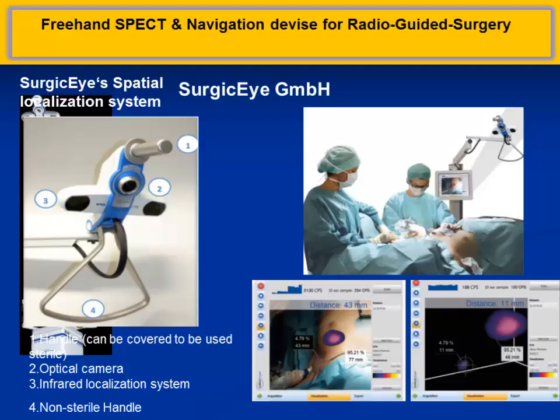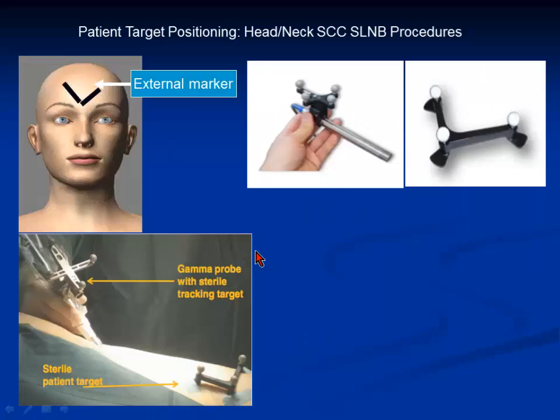Therefore, nuclear medicine is safe. You have to tell him half an hour I will image him, do dynamic images, and after that the surgeon can operate in the theater. The beauty of this is it will tell you exactly at what angle it is and what depth it is, and it will help the surgeon plan. And this is what we do now, though it costs about 120,000 pounds, I think, to buy this device. It's quite large, and we have moved a little bit extra.